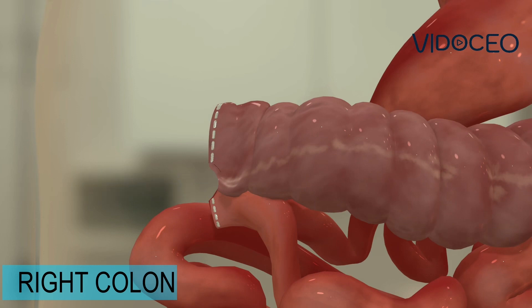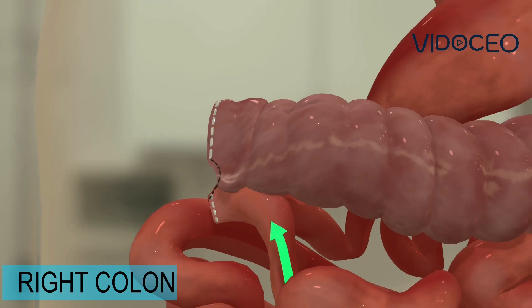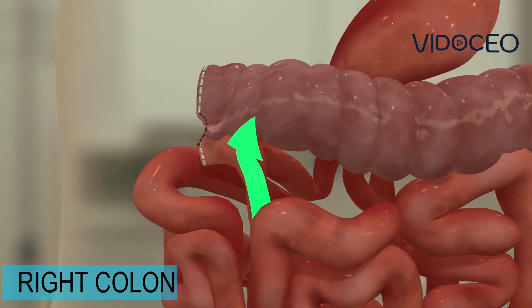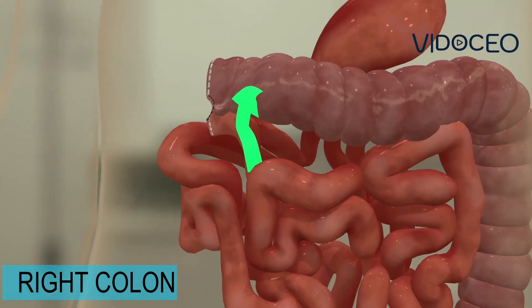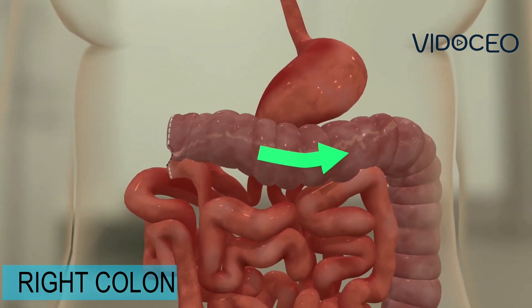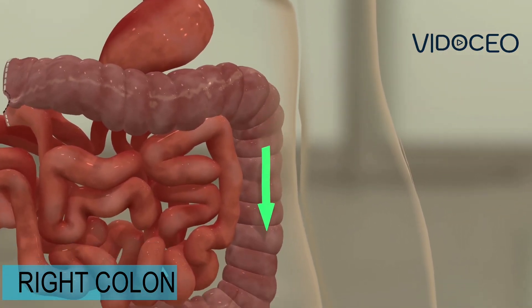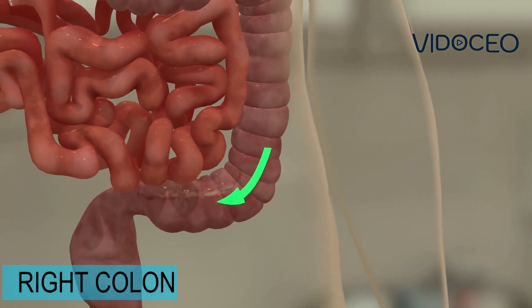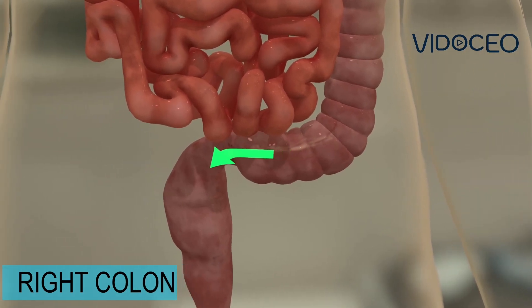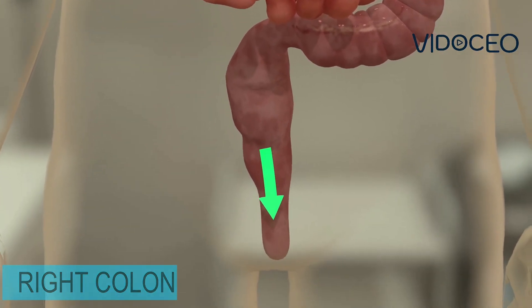The hole used for the stapler is closed, after which the lumen of the intestine is once again restored from top to bottom. Food can pass through the reconnection and travel through the remaining colon and out of the rectum and anus.